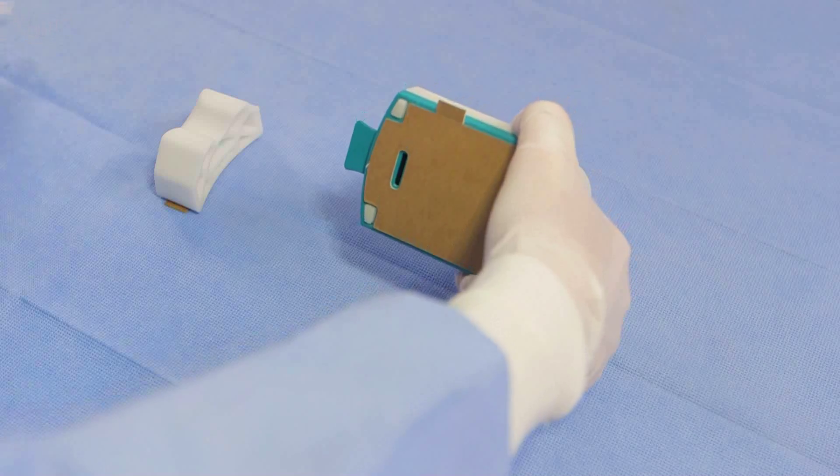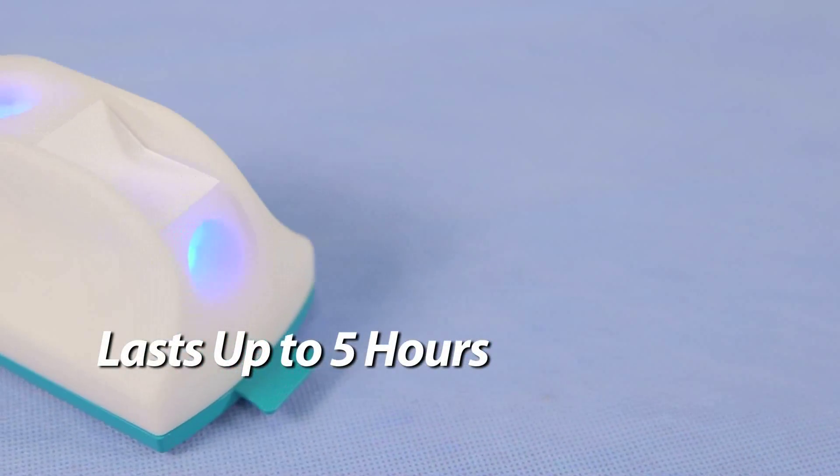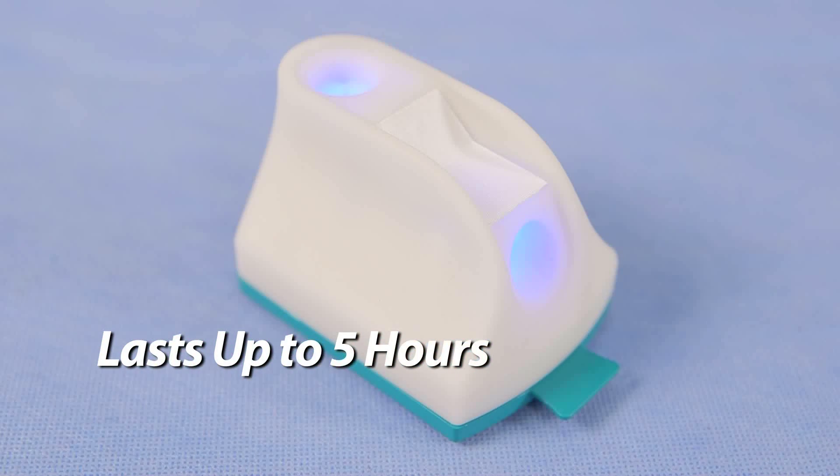By simply pulling the slip sheet, the unit is automatically activated, illuminating LED lights and providing easy port visibility, while warming the pre-filled cleaning and defogging solution.